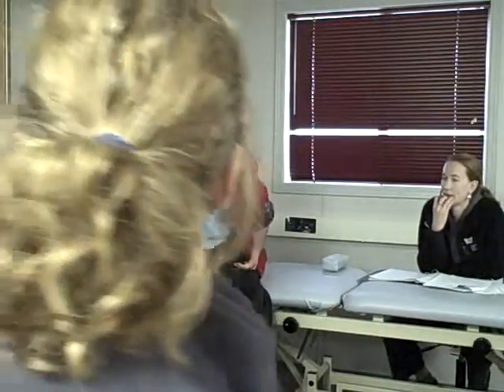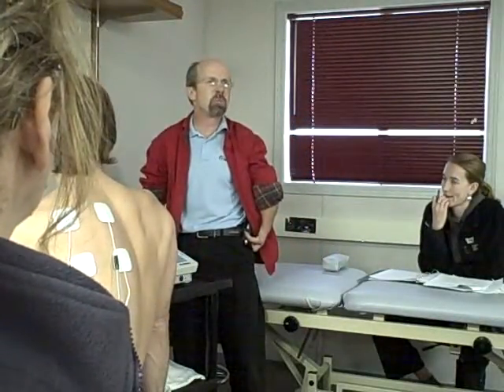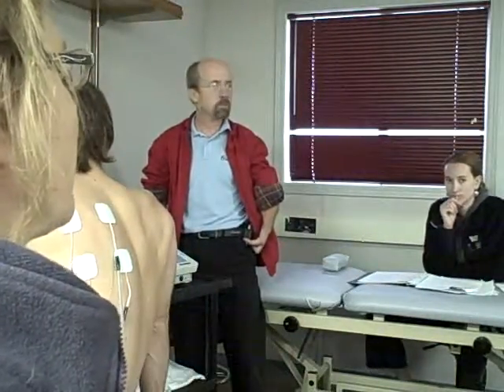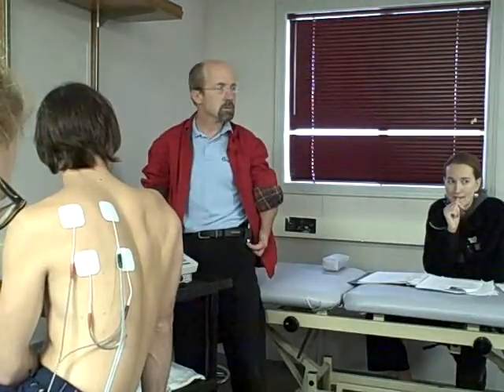Is there any reason during the treatment to change the intensity? I mean, is the body adapting? Probably the only reason would be acclimation. So the body has acclimated. They go, well, I can feel it, but I can use it up higher now. So that's the reason to come back after a couple minutes and check them and see how it is. 5 to 7 minutes after we started, 90% of the time I'll ask patients, how are you doing? And they're like, well, I really can't feel it anymore.